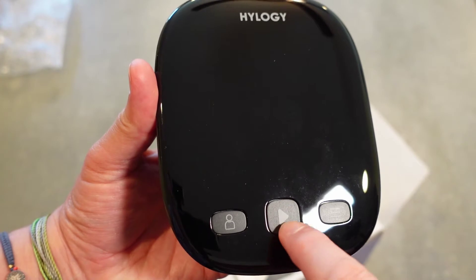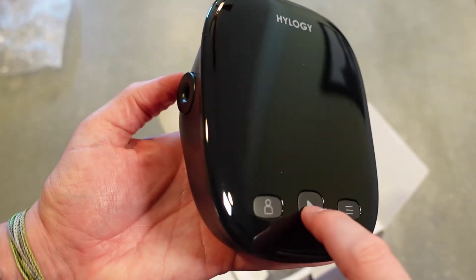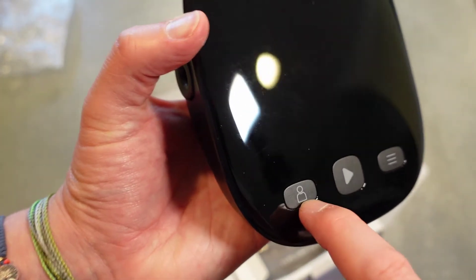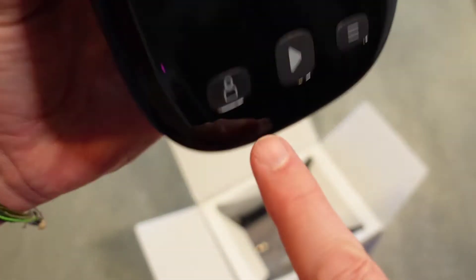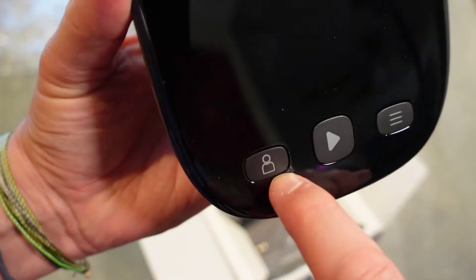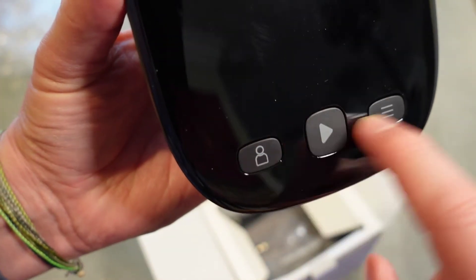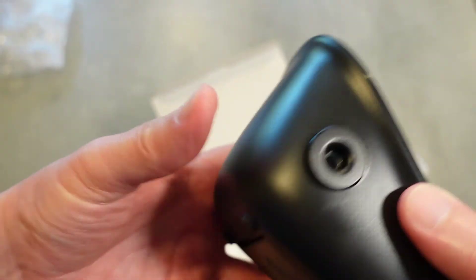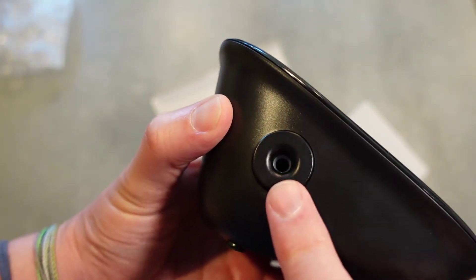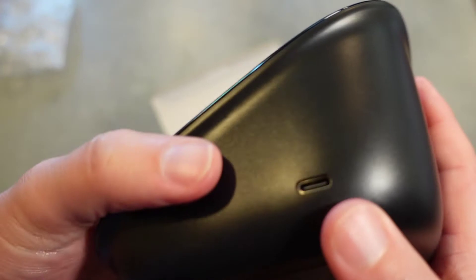You've got your play button which will be to start I'm assuming, and then your menu button, and then your people button which is probably going to be to switch between the two different people, two different memories. You've got your place where the cuff is going to plug in I'm assuming.